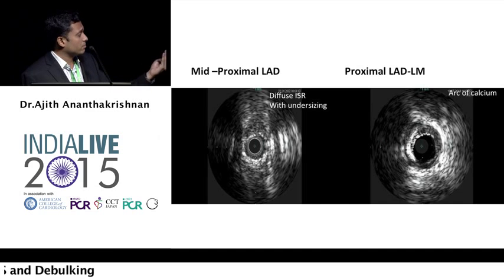But as we come proximally to the LAD, we can see that it's a 3.5 vessel, and this 2.75 stent is hanging in a 3.5. So the operator has not optimized the proximal stent with aggressive post-dilatation. So that was a problem which was leading to in-stent restenosis.